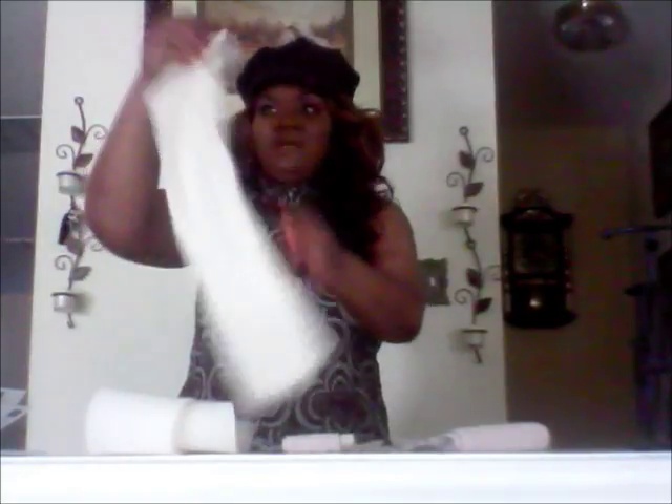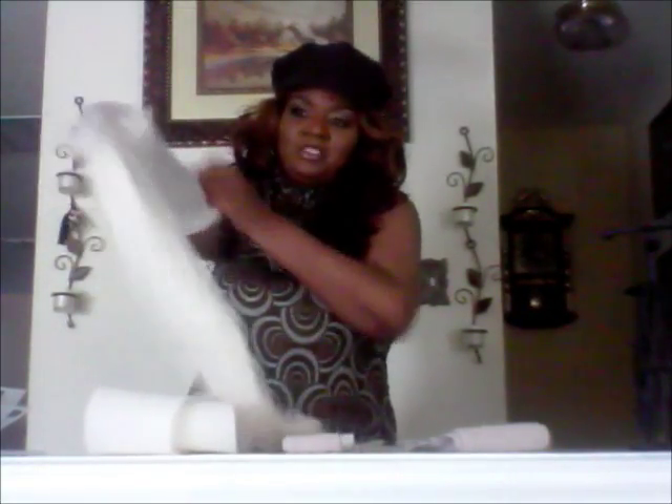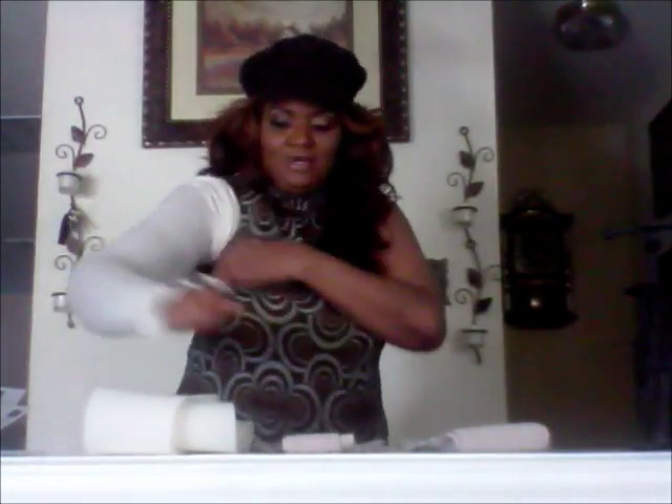So let me show you what I do to wrap my arm. I take my sleeve — this is my sleeve — and I place the sleeve on. Once I get the sleeve on, real good. Then I take this foam, a piece of foam, and I wrap my hand.